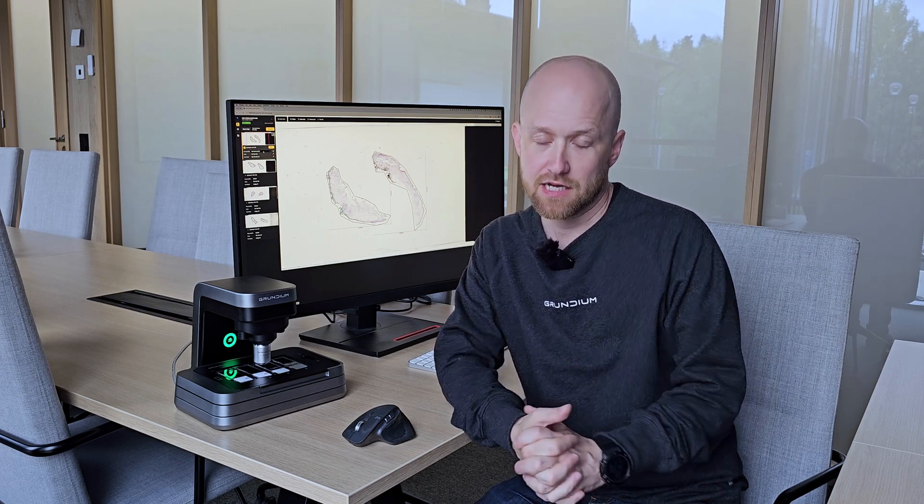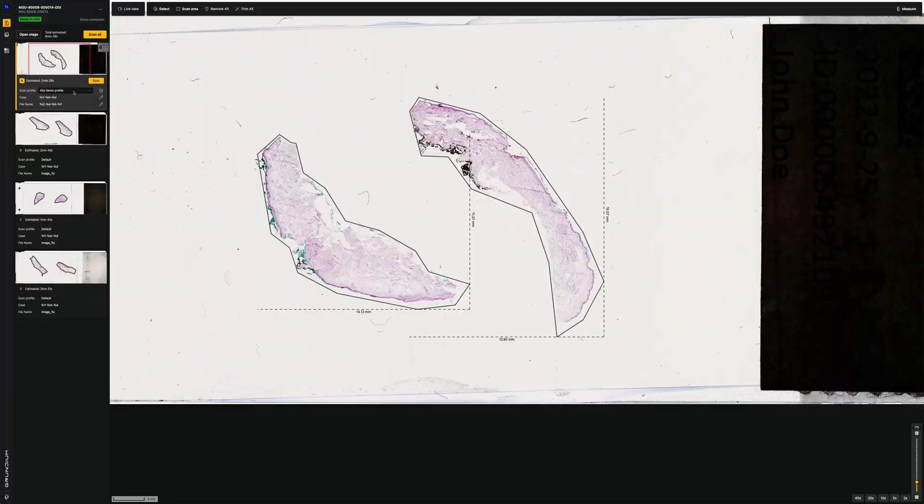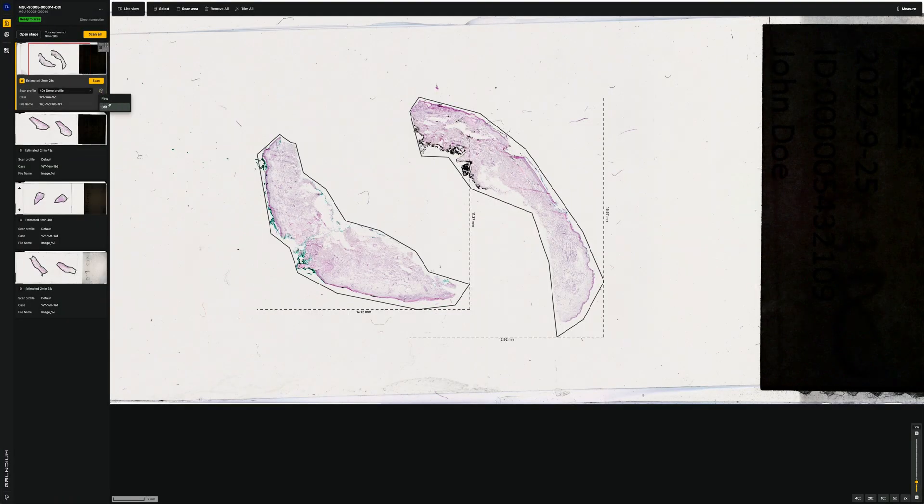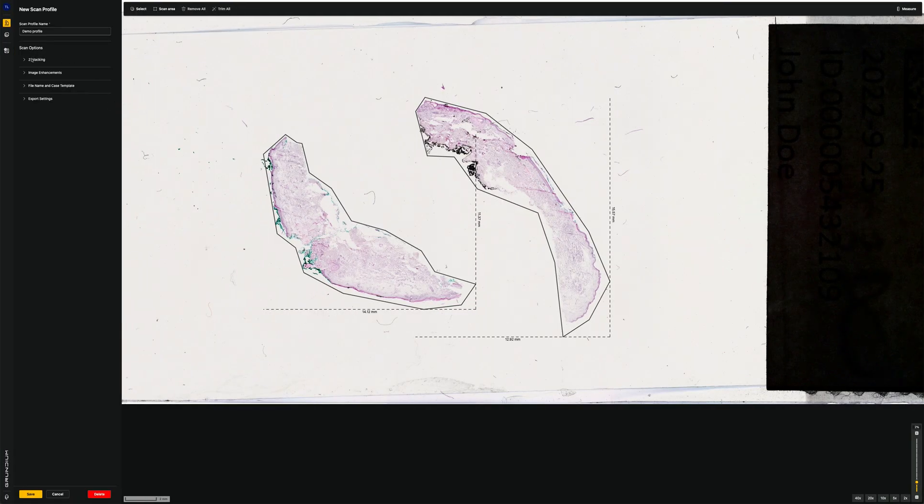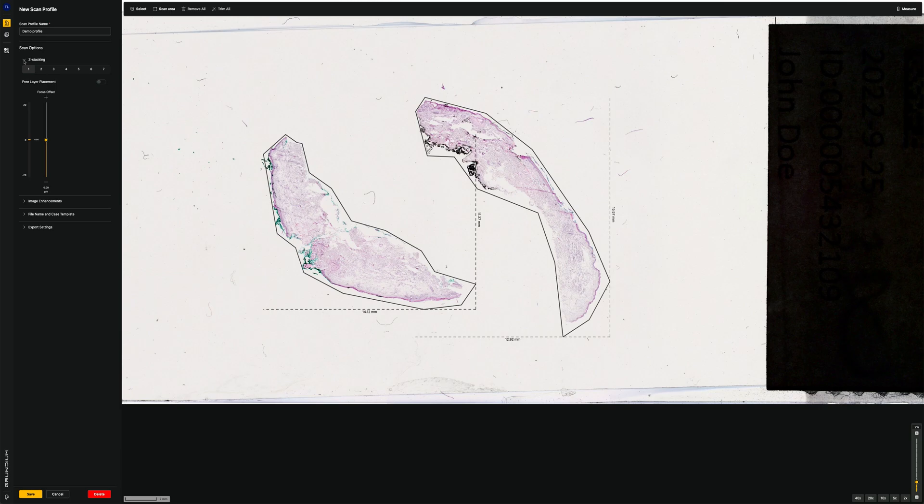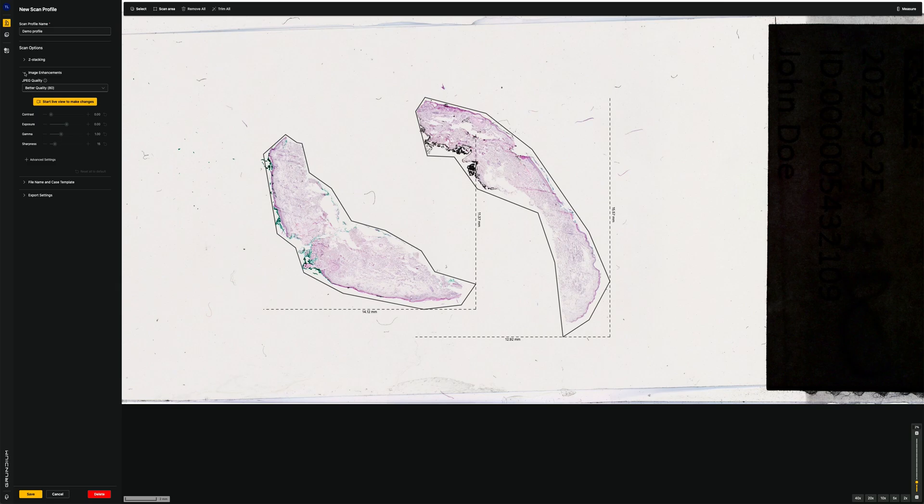One of the new features of the M system is scan profiles. Scan profiles is a set of configurations that you might want to change often. That would be, for example, z-stacking options. We can z-stack up to seven layers. Then there are image enhancements. If you want to adjust how the images are shown, we may want to adjust that based on sample types.